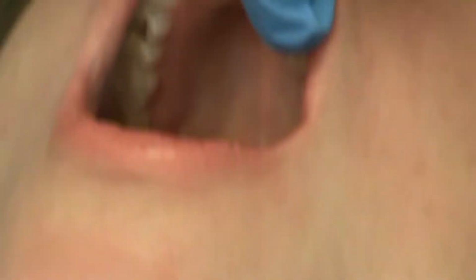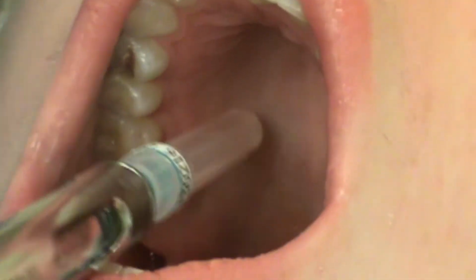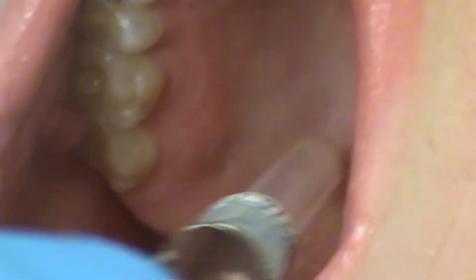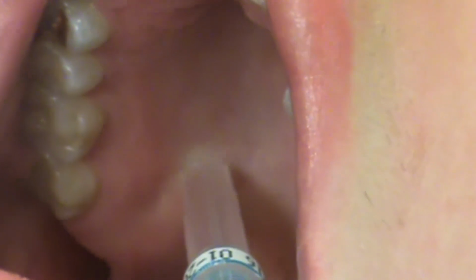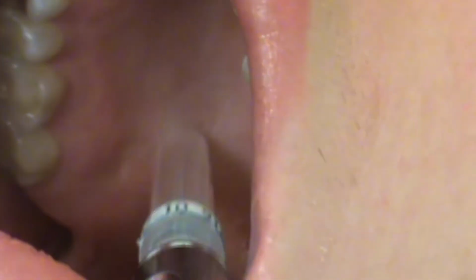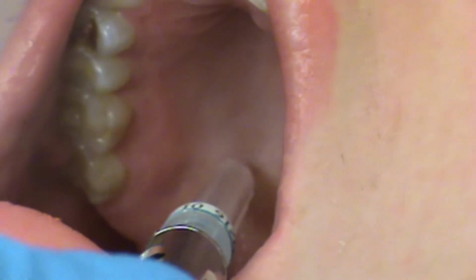Then the palatal injections, open kind of wide and turn to the right just a tiny bit, thanks. If you take a look, the tissue is nice and hard, solid, and we get back here and it dips. You see how I can dip that? Look, here, doesn't move, doesn't move, doesn't move, doesn't move. Boom, drops right in. That's where your fossa is, right above the foramen where the greater palatine nerve drops out, or comes out of the cranium.